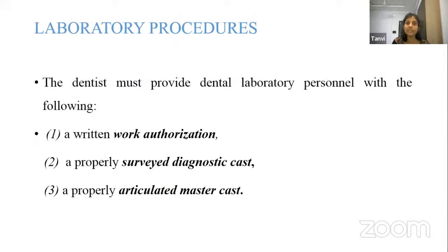So, coming to the laboratory procedures, what the dental laboratory personnel receives from the dentist is a work authorization form, as we just discussed. And then he also receives a properly surveyed diagnostic cast. The technician prepares the cast, does the proper design on it, does the survey on it.